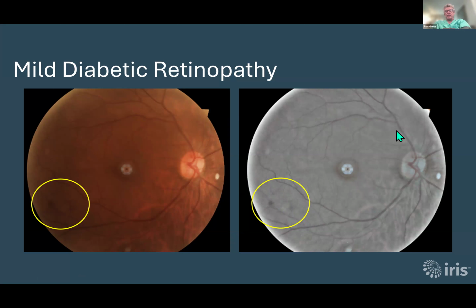And that's the reason as things change, we're able to determine, yes, this is way earlier than any other end organ damage that we can detect from glaucoma. Or sorry, I do glaucoma, from diabetic retinopathy.